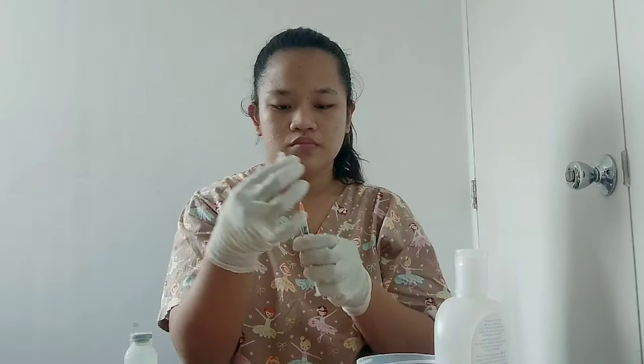Then we are going to uncap the syringe and hold the needle using your thumb and your forefinger, holding it as if you are holding a dart. Then we are going to insert the needle quickly and firmly at a 45-degree angle.